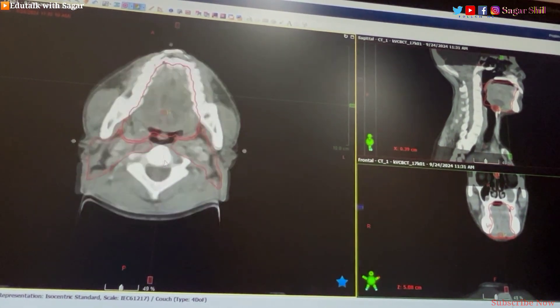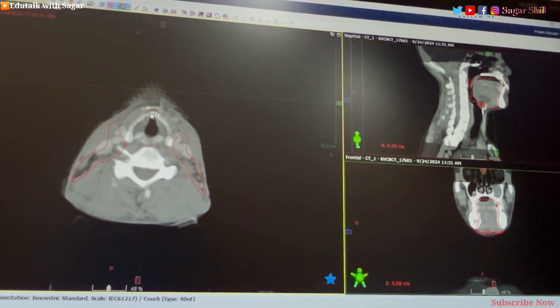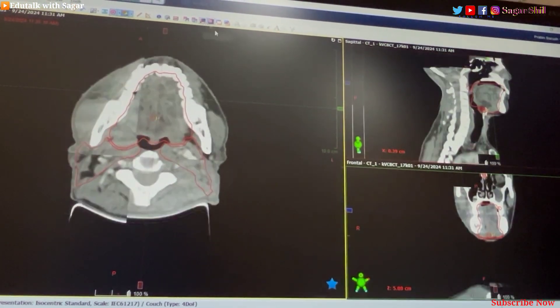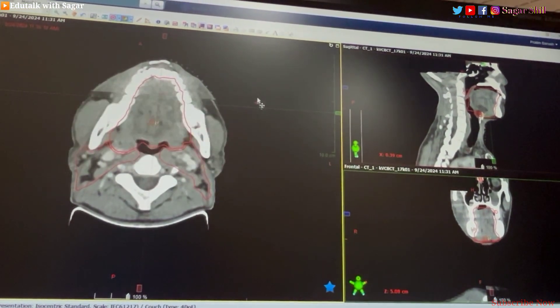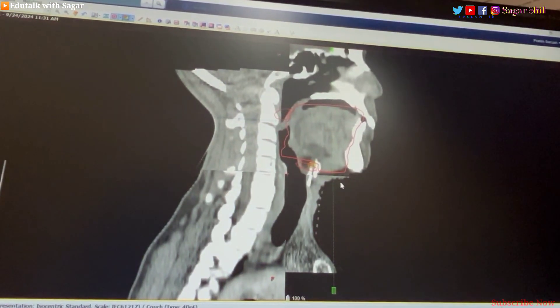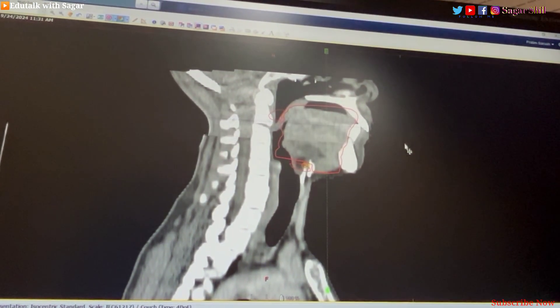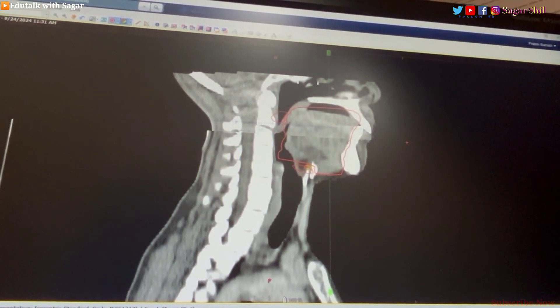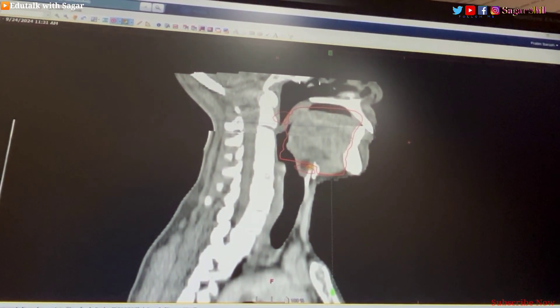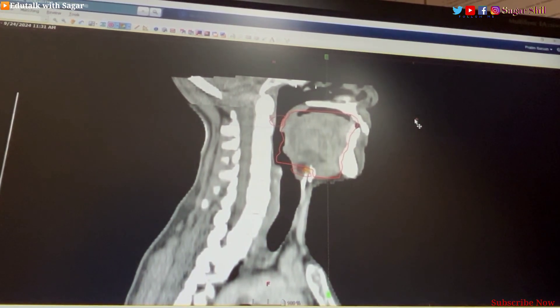First of all we should match the targeted area. For this floor of mouth case, first we should match the spinal cord — the cord should be matched — and after that the mandible and chin should also be matched.